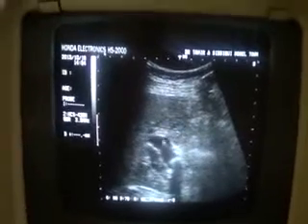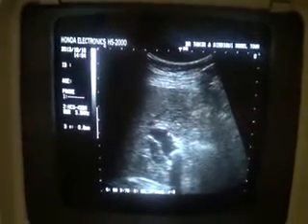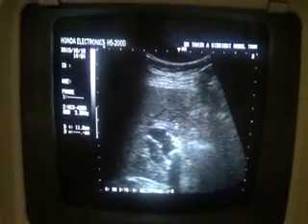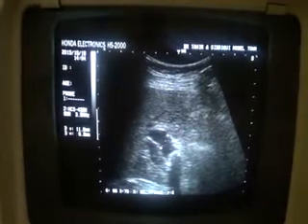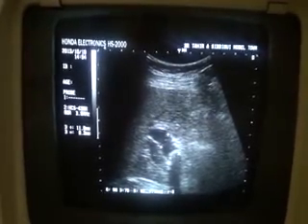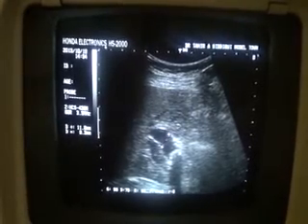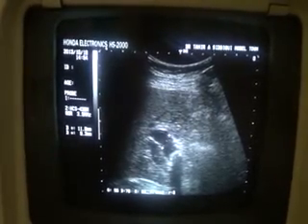Again, this is the portal vein. This is the common bile duct, which measures 11.8 millimeters — more than 7 millimeters, so it is enlarged. This is the calculus that measures 9.3 millimeters. So this is confirmed as a case of choledocholithiasis.